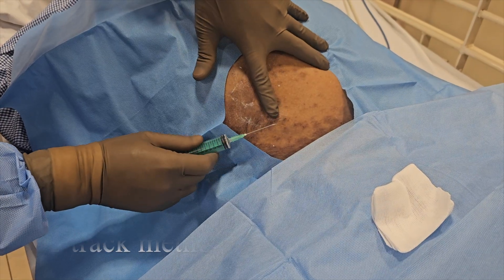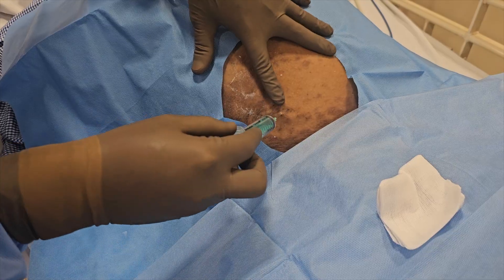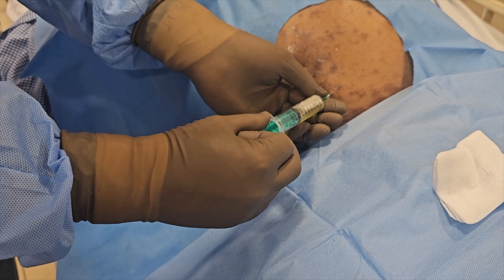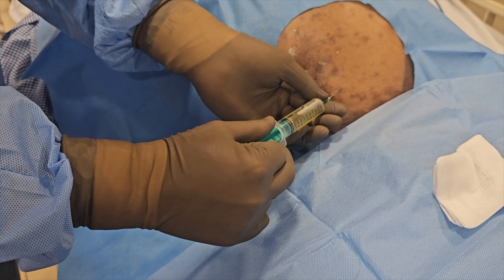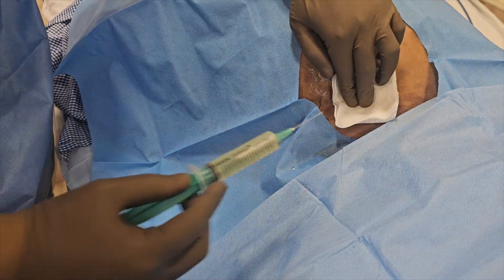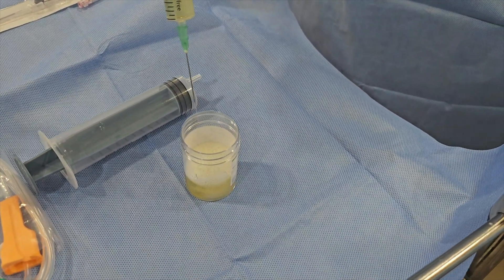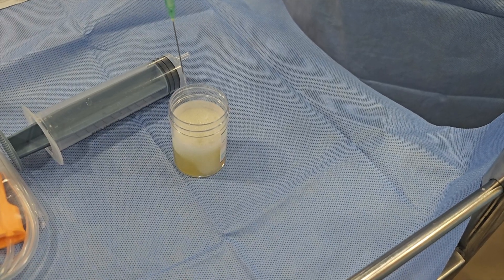The needle is directed in a z-track method so that there will not be any seepage of ascitic fluid post procedure. Biochemical testing of the fluid helps in detecting whether the ascites is exudative or transudative.